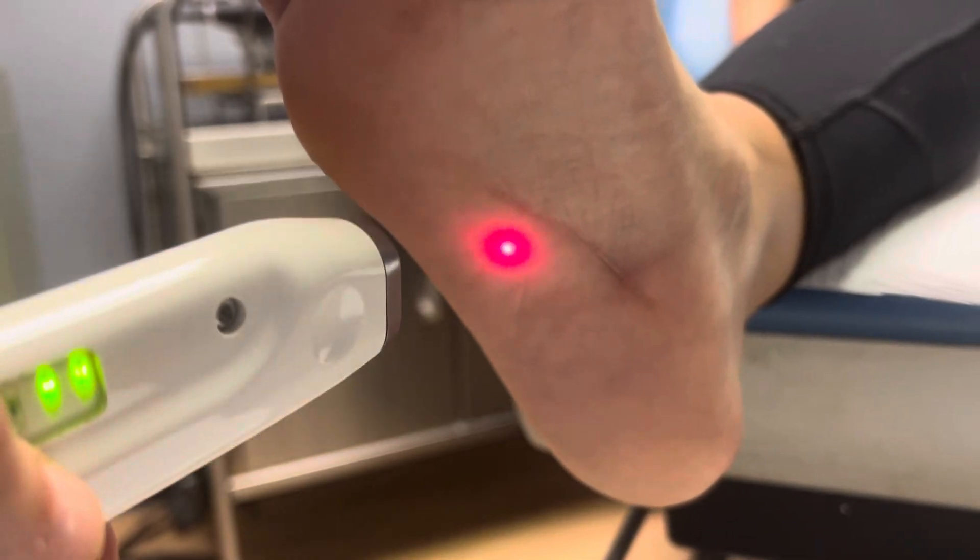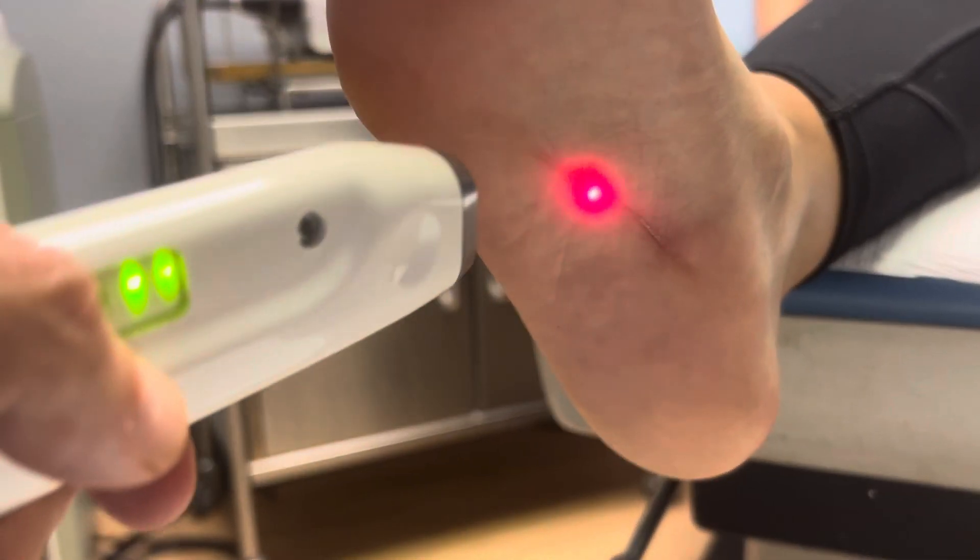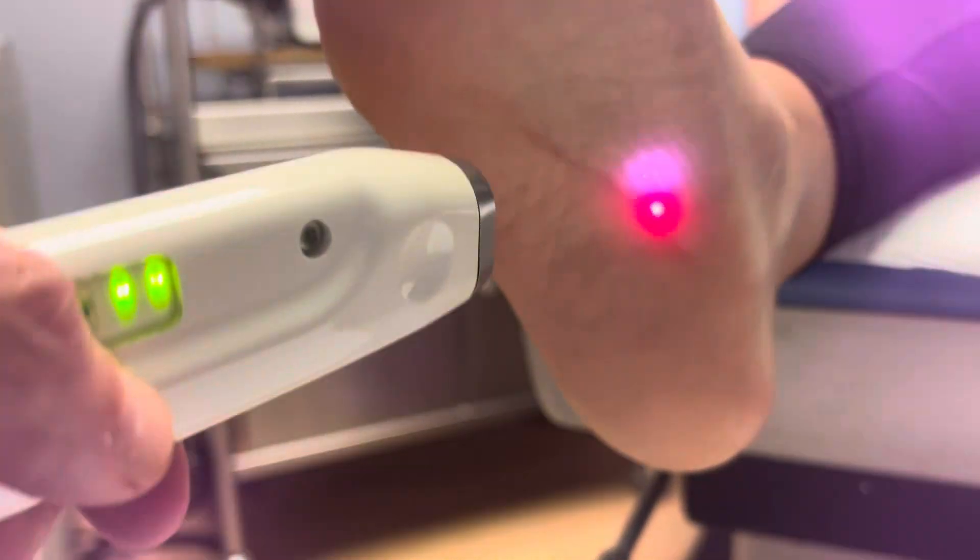We keep the probe moving during the treatment because it does get a little bit warm. And tell everybody what you're doing at home.